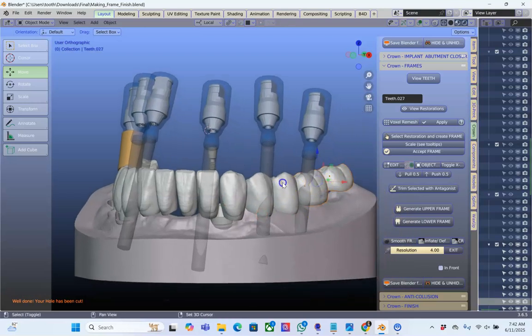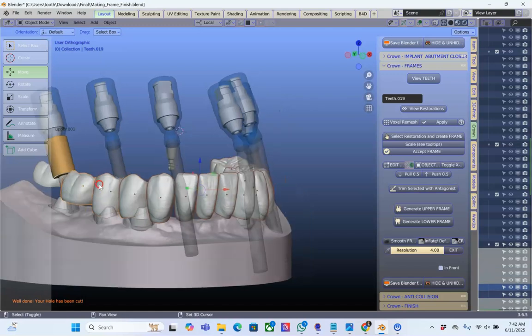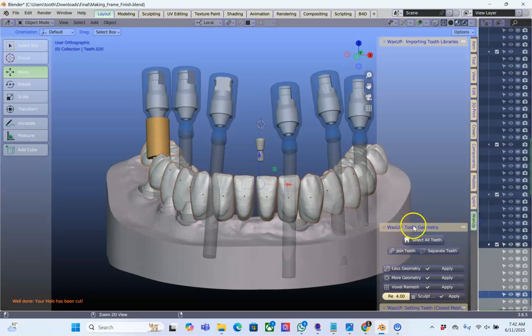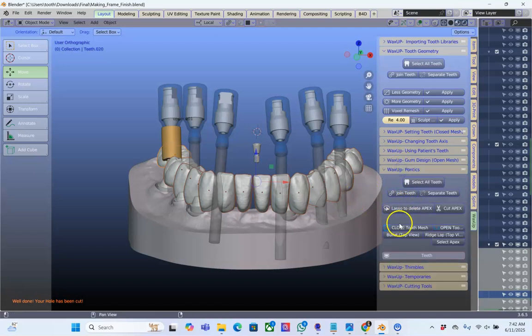Now, we don't use open libraries in this. So what I'll do is we'll just close this down. We need to close these. So not close down, we need to close these. Go into the wax up and go to the pontics and just close these teeth up. It's important.